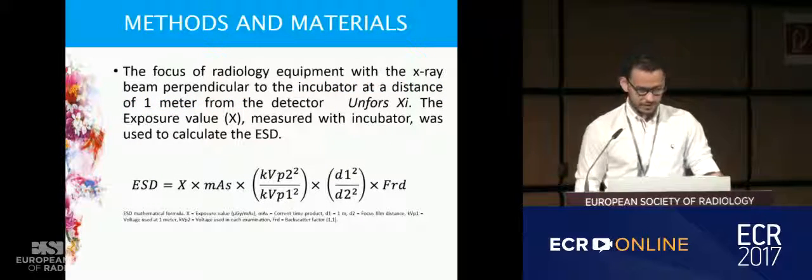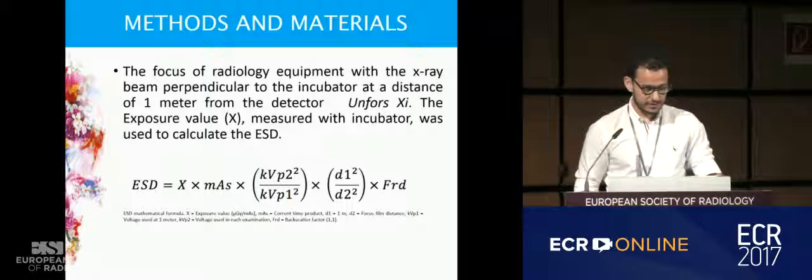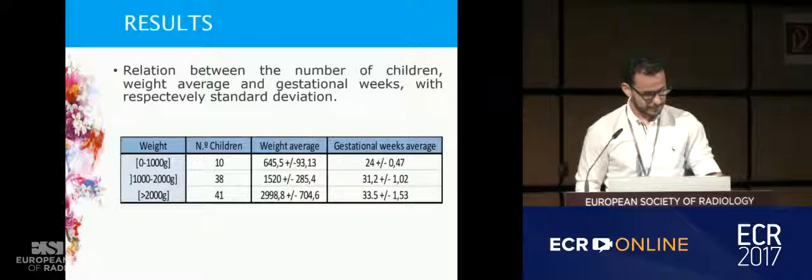which was 5 millimeters thick. The focus of the radiology equipment was with the X-ray beam perpendicular to the incubator at a distance of 1 meter from the detector, and with the exposure values measured, we calculated the ESD by this formula here.